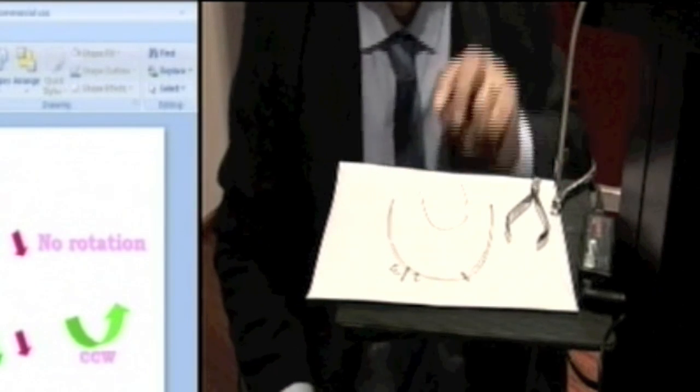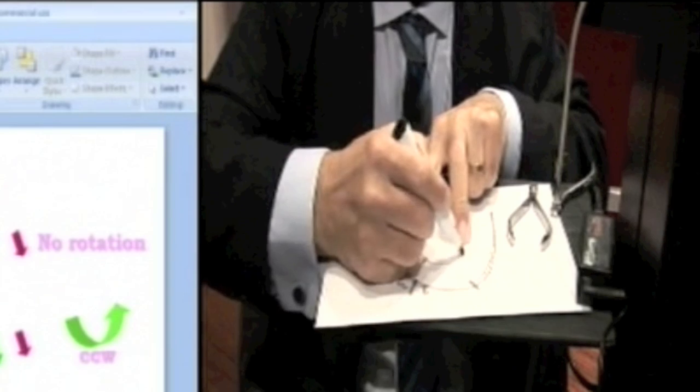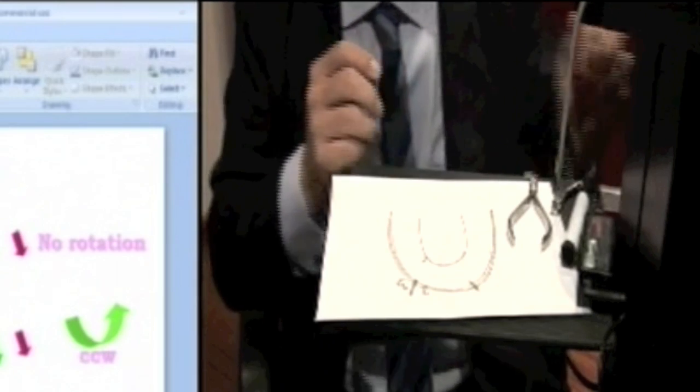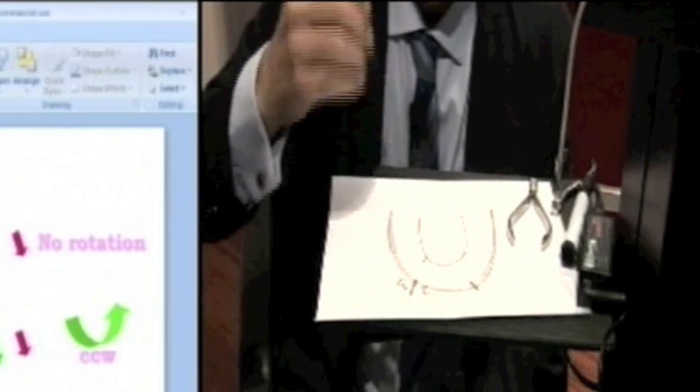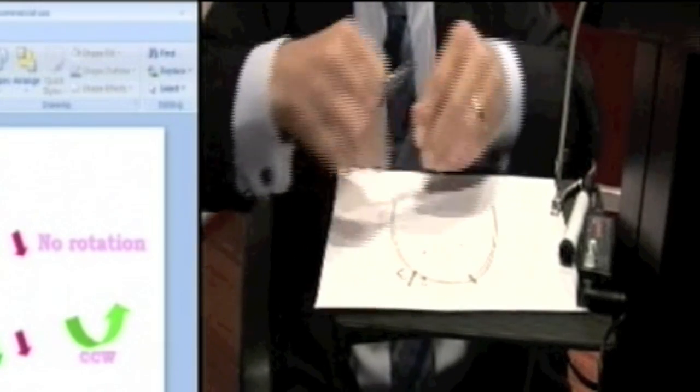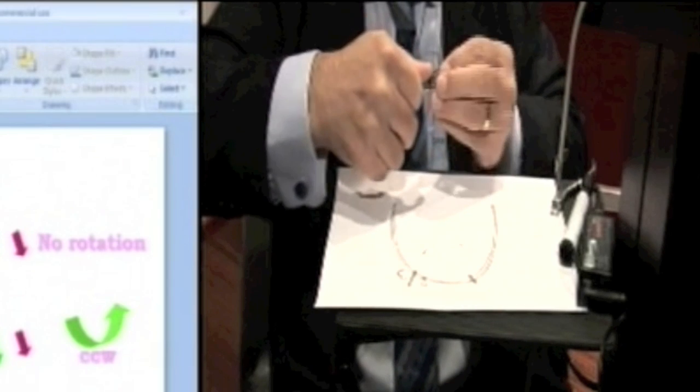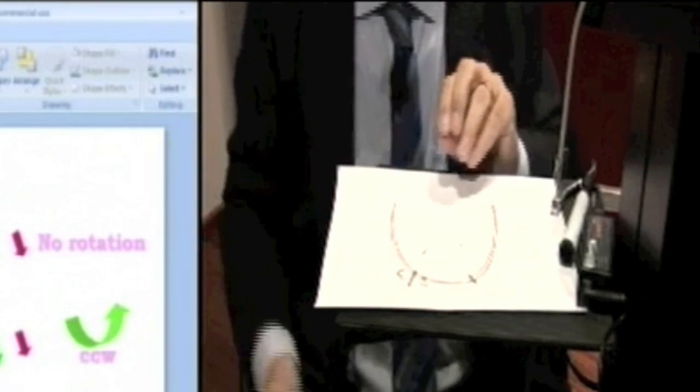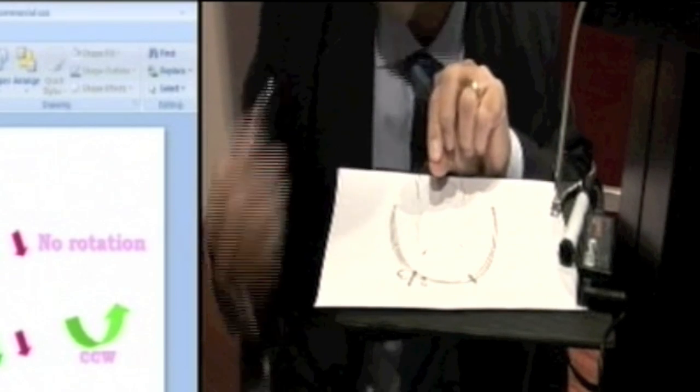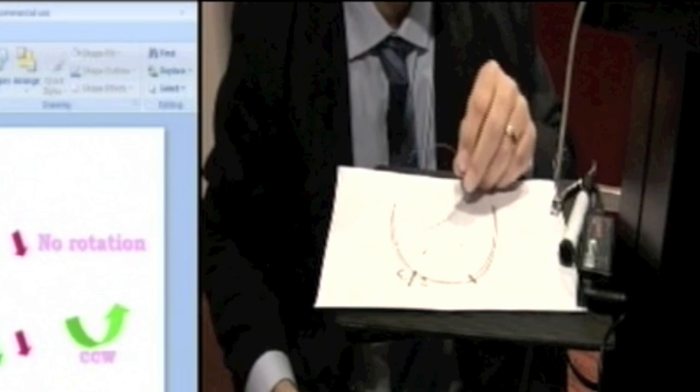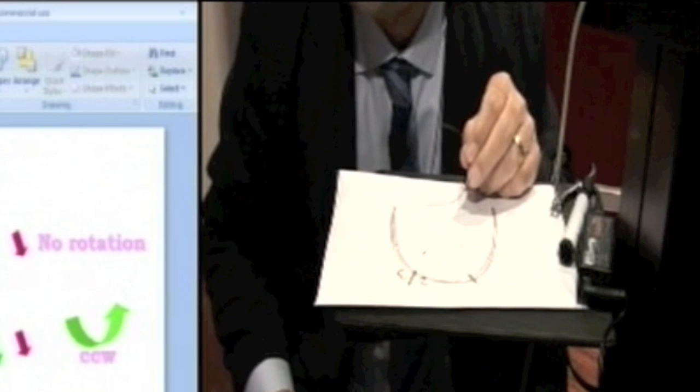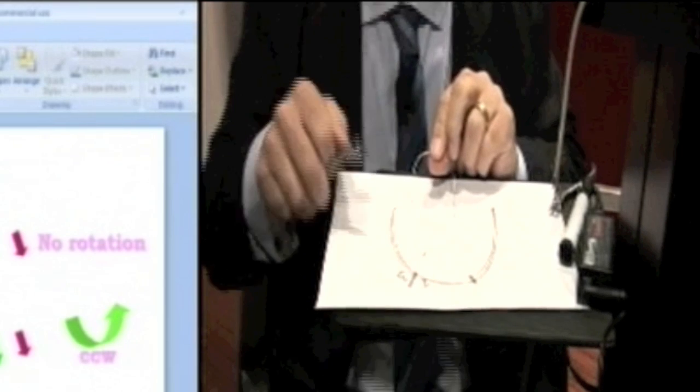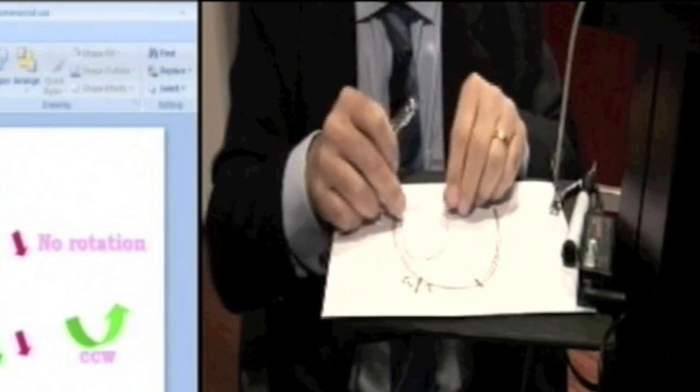You mark the wire between the canine and the lateral. Now, a good way for you to confirm you haven't introduced unwanted torque is to put a bend at the end of the wire. This is called a goalpost bend. You need to cut that goalpost off before you put it in the mouth. Otherwise, you'll have some very nice intrusion.